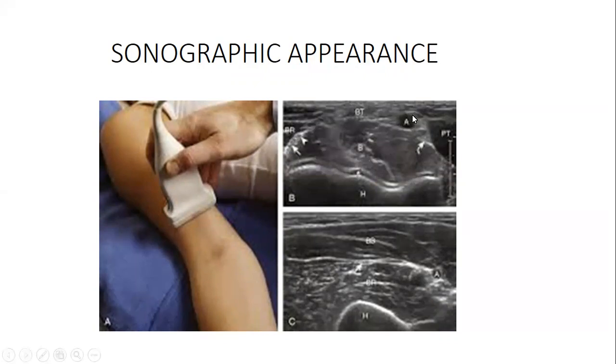Now this gives you a sign that this is the medial portion, this is the lateral portion. And if this is the lateral portion, it also makes sense to start identifying the structures. These structures can only be appreciated if you understand the anatomy. As long as the anatomy is not comprehensive, you are going to miss things. Now, just posterior to the brachial artery, you are going to have the nerve here. Sorry, you still have to forgive me, the images are not clear. But what I'm trying to explain is that specific structures will help you know specific structures adjacent to them.